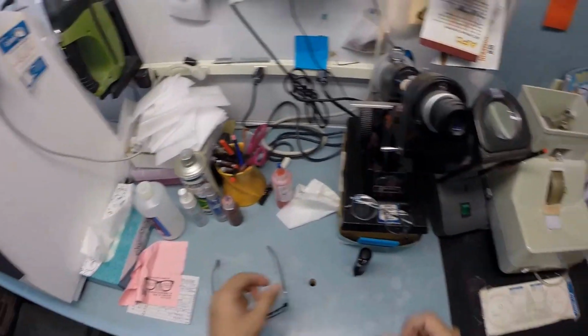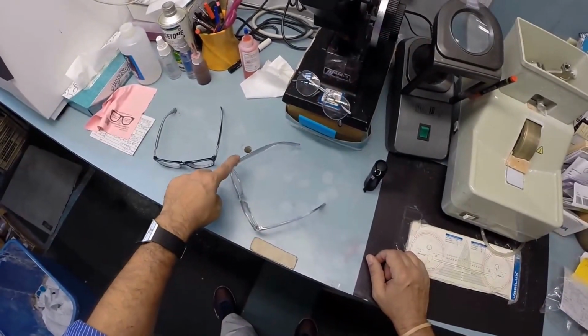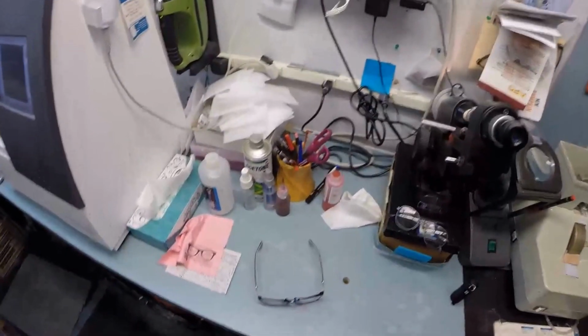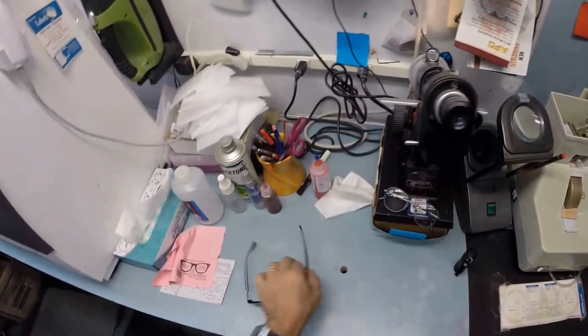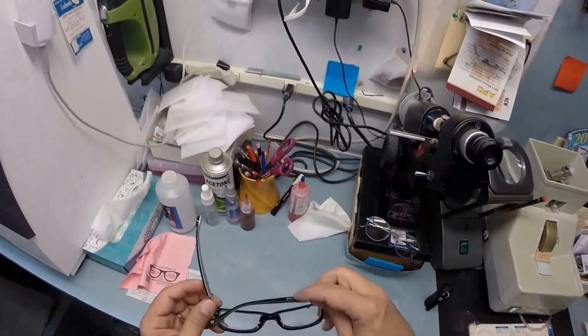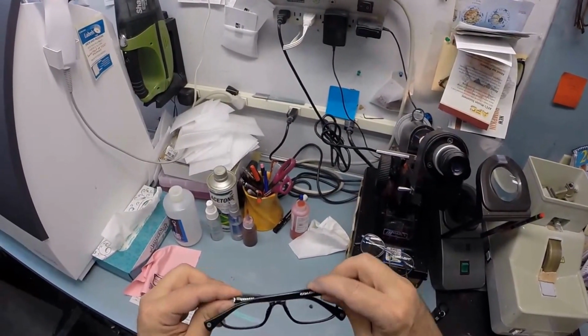There is no wobble. And when I say wobble, I'm part of that 80%. I have one ear that's higher than the other. So when I take mine off, they wobble on the counter, but they sit level on me. Let me put mine back on so I can see what I'm doing. Flip those over, press down, there is no wobble. I close each temple to make sure they overlap perfectly, and they do, and the temples are not askew in any way.